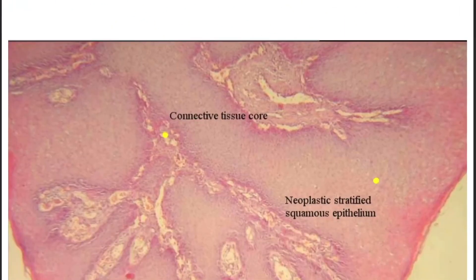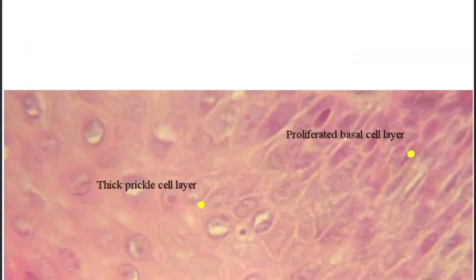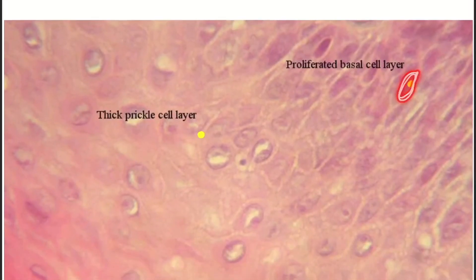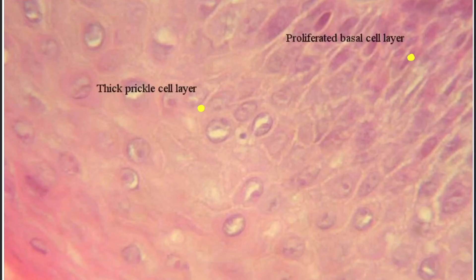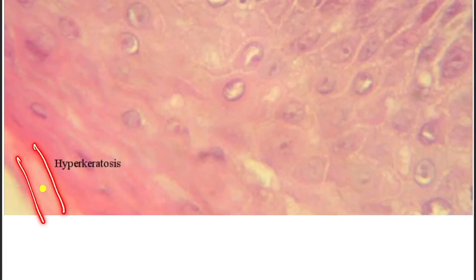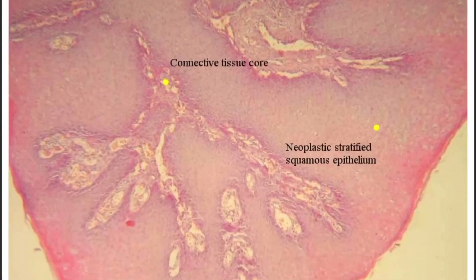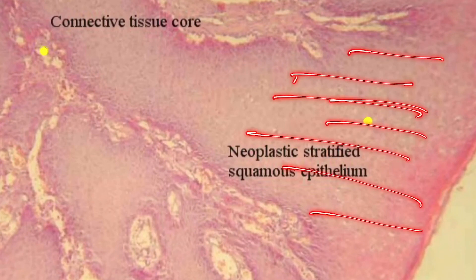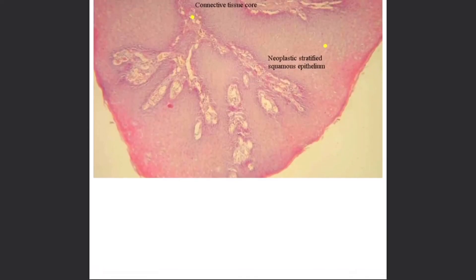Now let's see the histopathological features one by one. First, you can see the proliferated basal cell layer. Second, you can see the thick prickle cell layer. Third, here you can see the hyperkeratosis of the stratum corneum layer. And here you can see the neoplastic stratified squamous epithelium. These are the features of squamous cell papilloma.